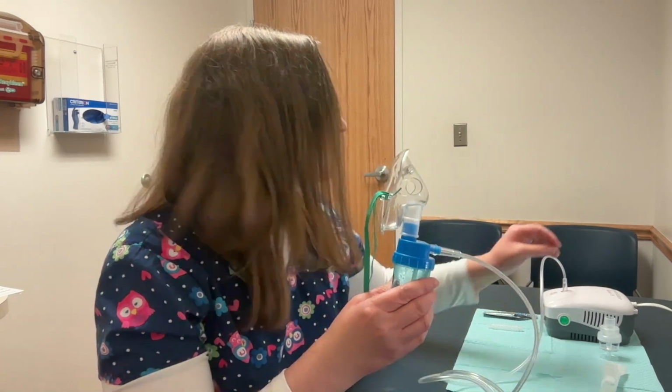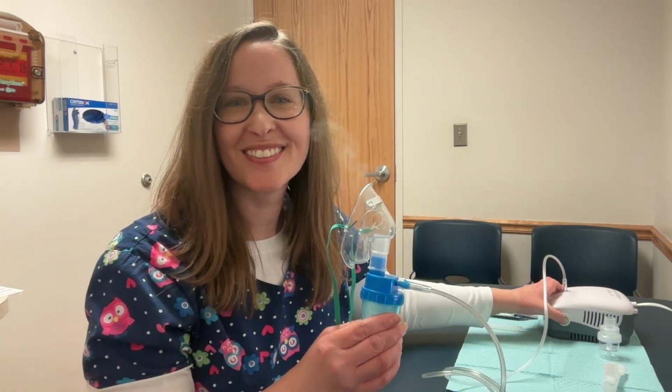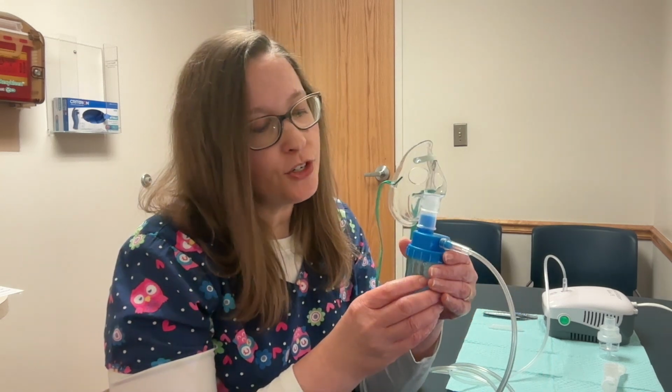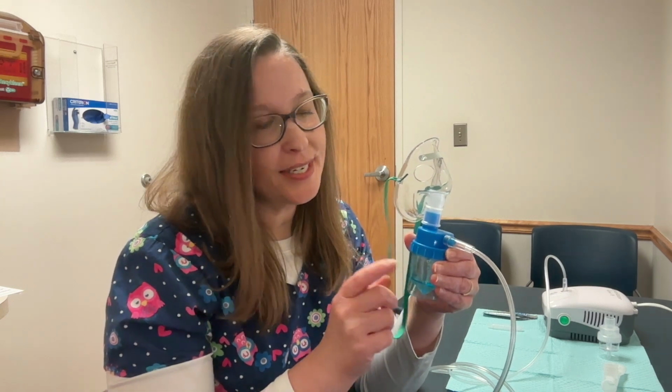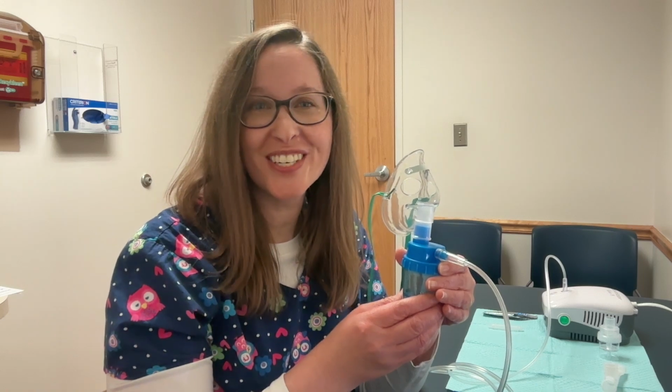Now we're going to turn on the nebulizer machine and look for mist to come out. That mist is the medication to complete this breathing treatment. You'll want to deliver the amount prescribed, and you may need to tap the medicine cup to bring the droplets back down to nebulize into mist. Thanks for learning how to use a nebulizer for the pediatric patient.